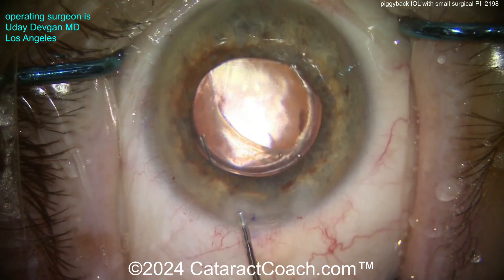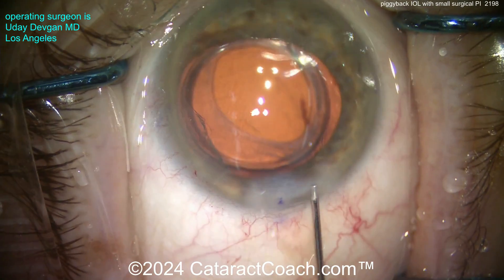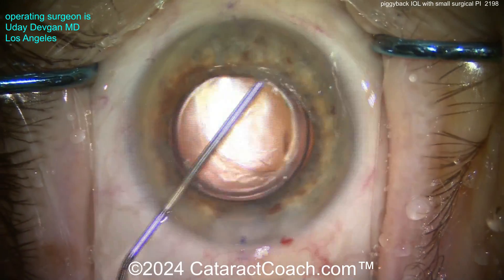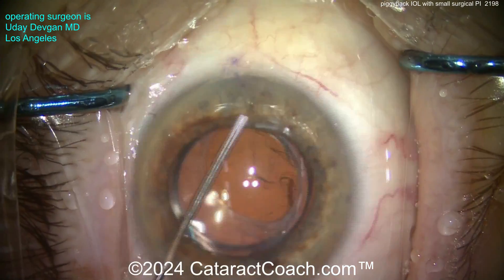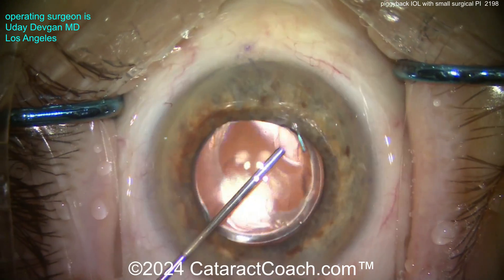We'll put in some miotic agents. Once the incision is sealed, note that with this lens we tend to use a slightly larger incision — about 2.75 to 2.8 mm. Going back inside, we can make sure there's no retained viscoelastic and bring the pupil down. It's a beautiful-looking case.